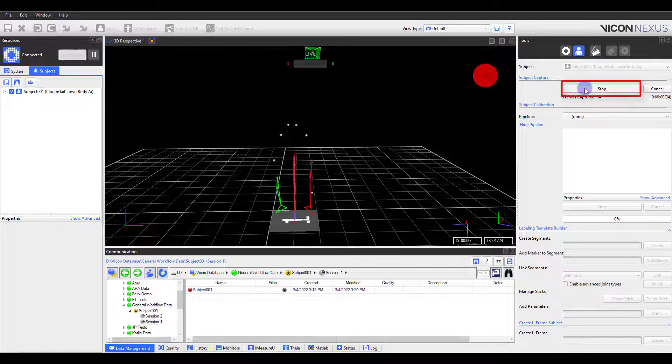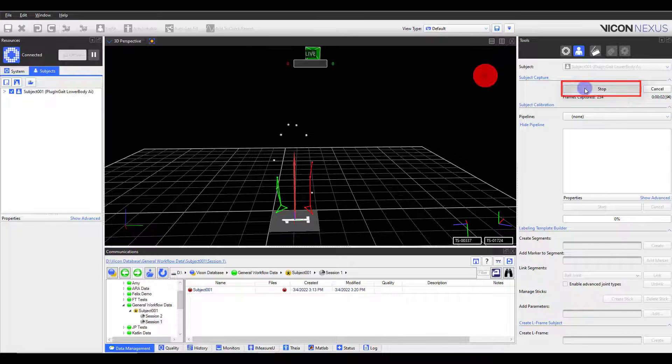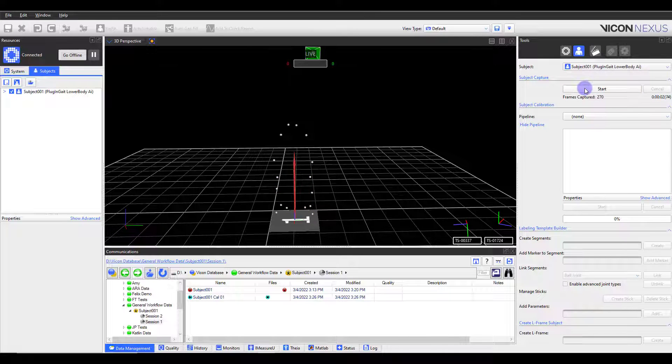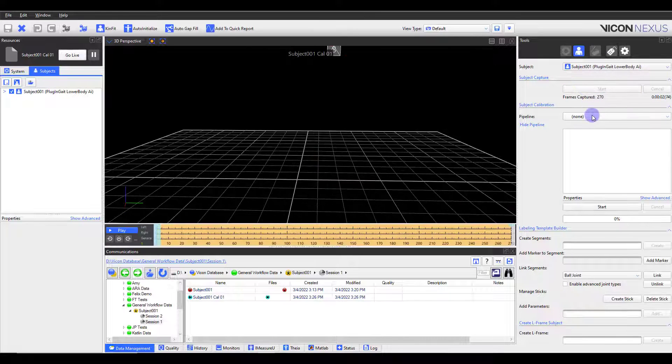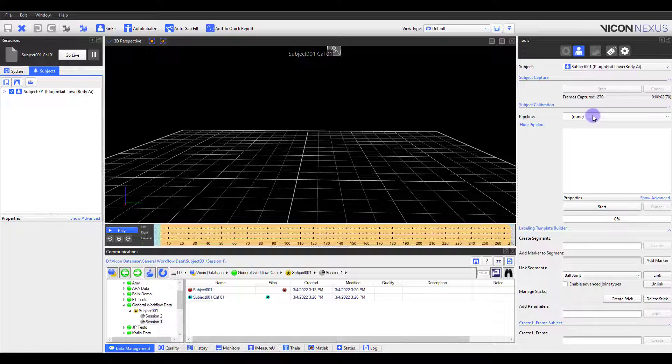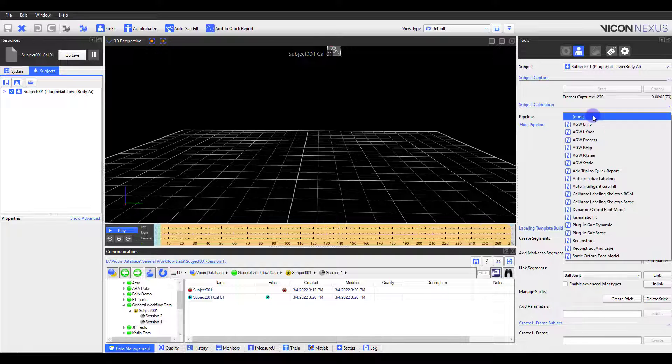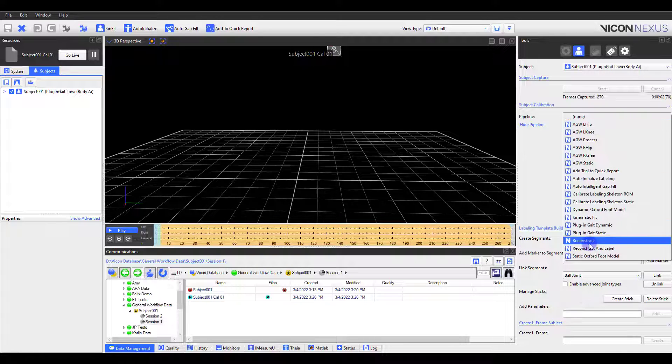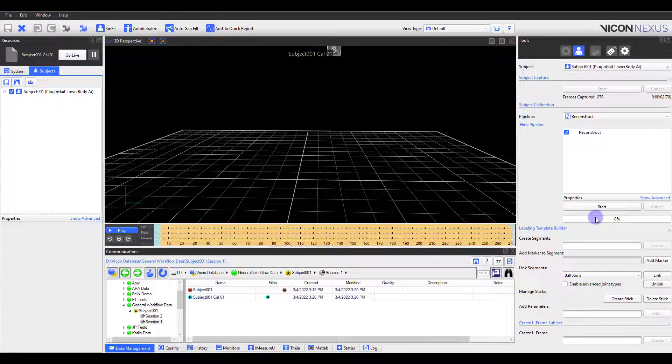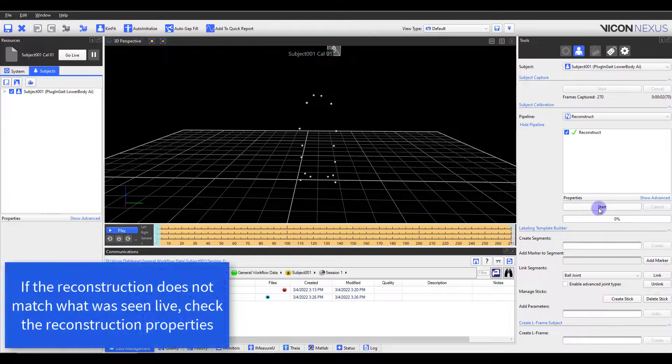I'll click Start, collect a few frames, then click Stop. The trial will be named Cal01 and will automatically open. Since Nexus only records raw camera data, I will not see any markers initially, so I will need to run the reconstruct pipeline.